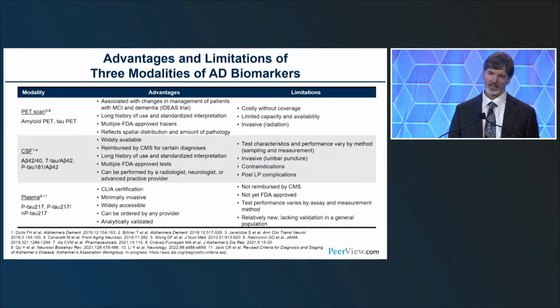But PET scans have been around for a long time. We understand them in imaging very well. There's multiple FDA-approved tracers. However, they are costly. There's some radiation involved, which scares some people. There's limited capacity. CSF is also approved by the FDA.